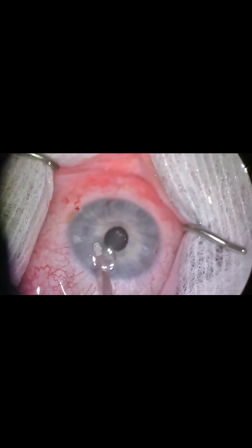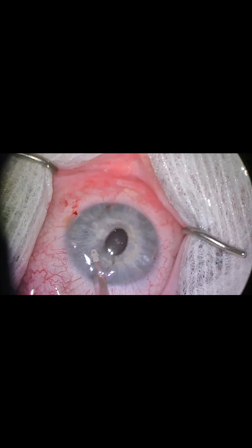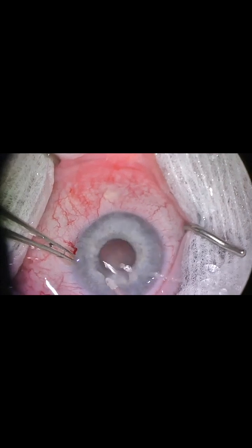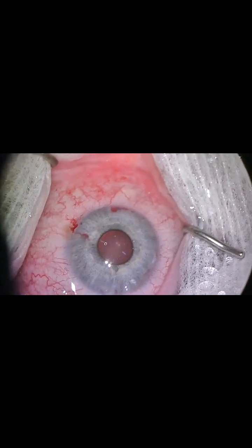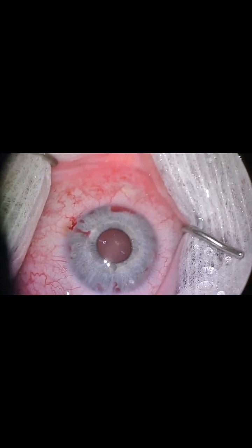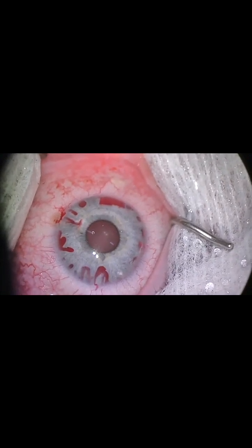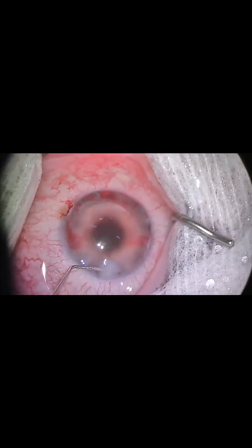The last part is removing the OVD. As you can see, after removing the OVD, there is bleeding from all over the angle, and that's one of the complications of this procedure. But fortunately, the bleeding usually is resorbed after a few days or few weeks. This patient did really well, and the pressure was below 20 with one medication 4 months after the surgery.